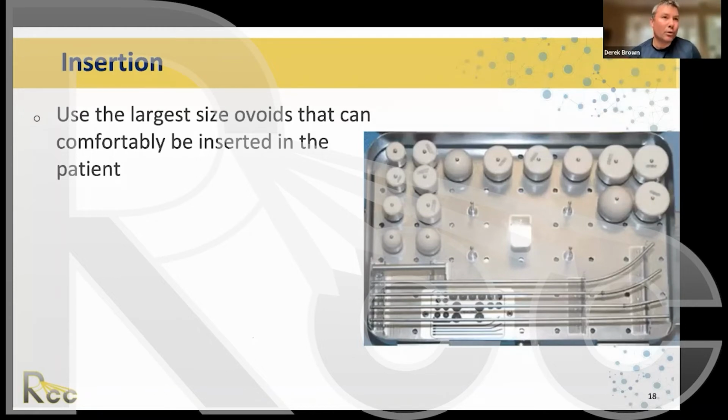So using a C-arm, we would also recommend using a Foley catheter in the bladder, maybe even with some contrast in it, so you could know where the bladder was. And then we would also recommend putting some radio-opaque beads in the rectum, so you would be able to know where the rectum is, and that would give you some idea. And then of course you'll be able to see the bladder.